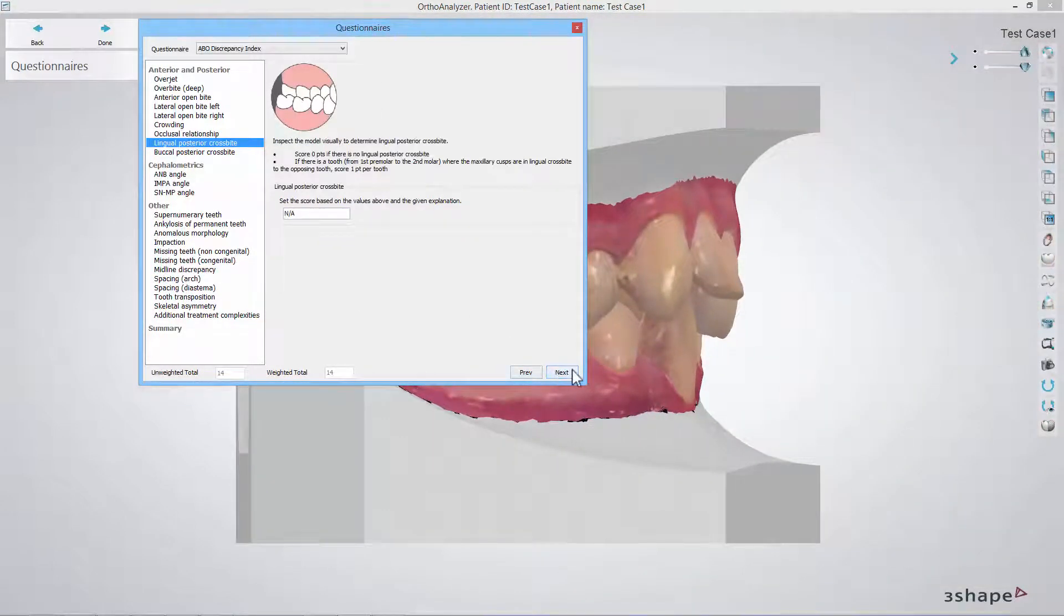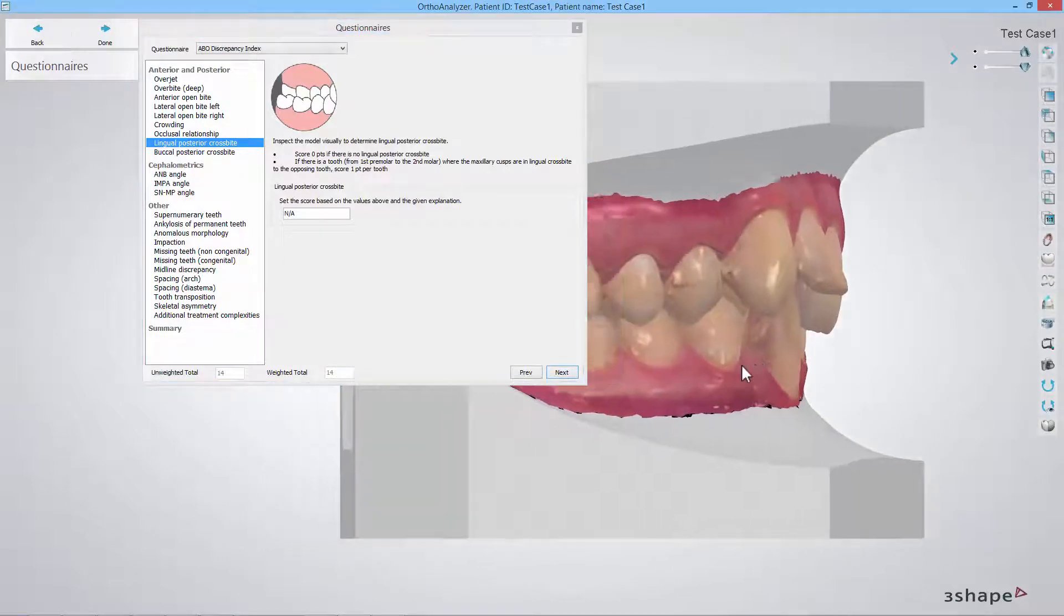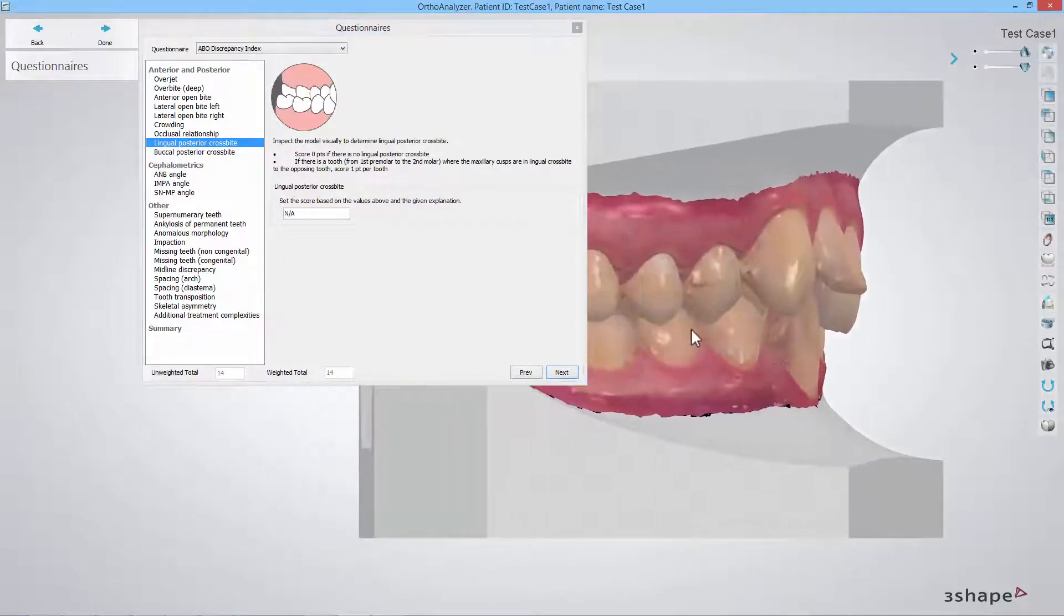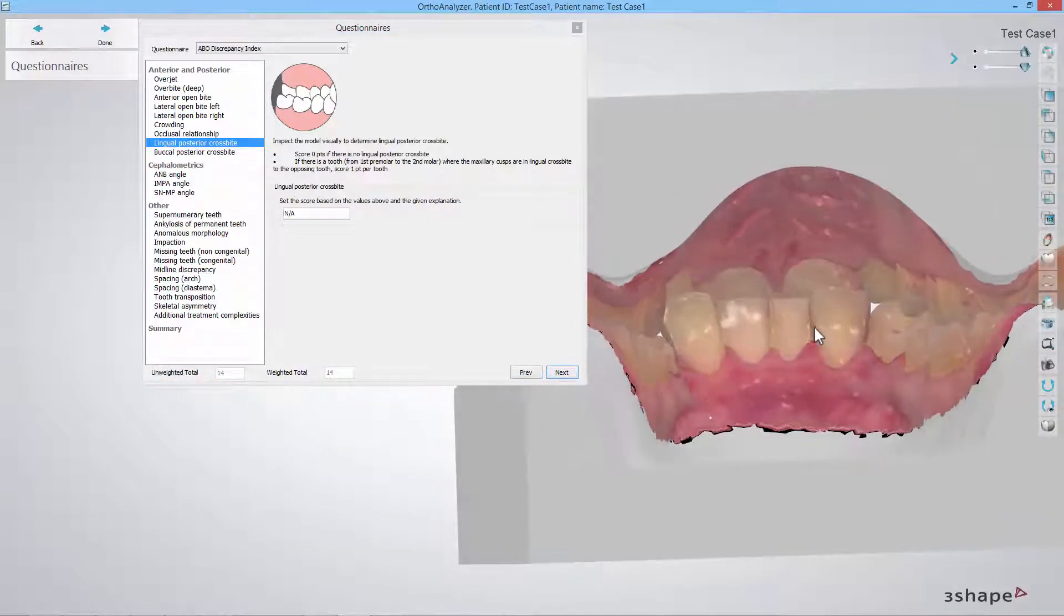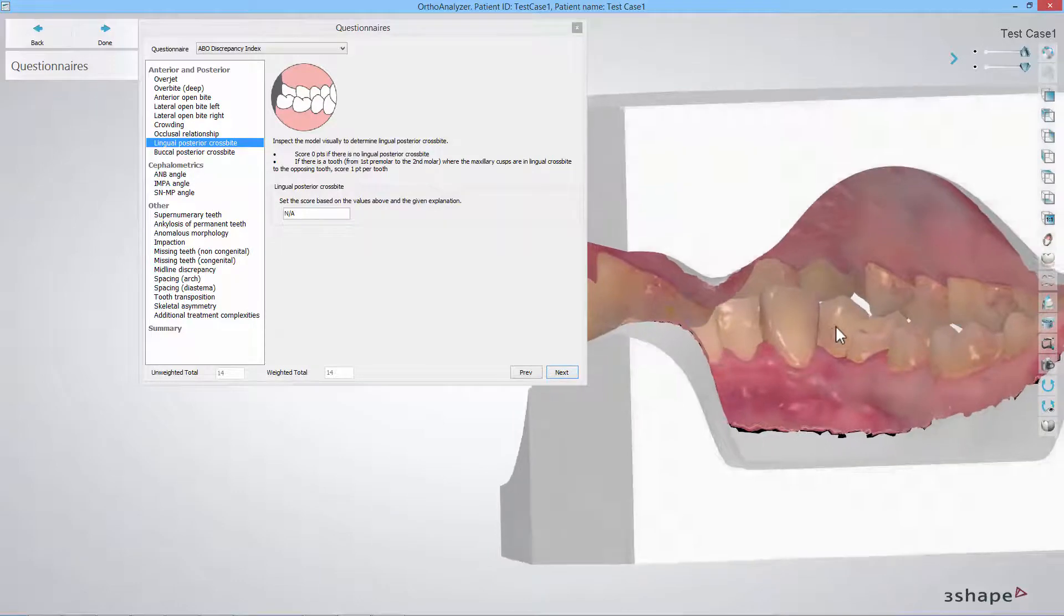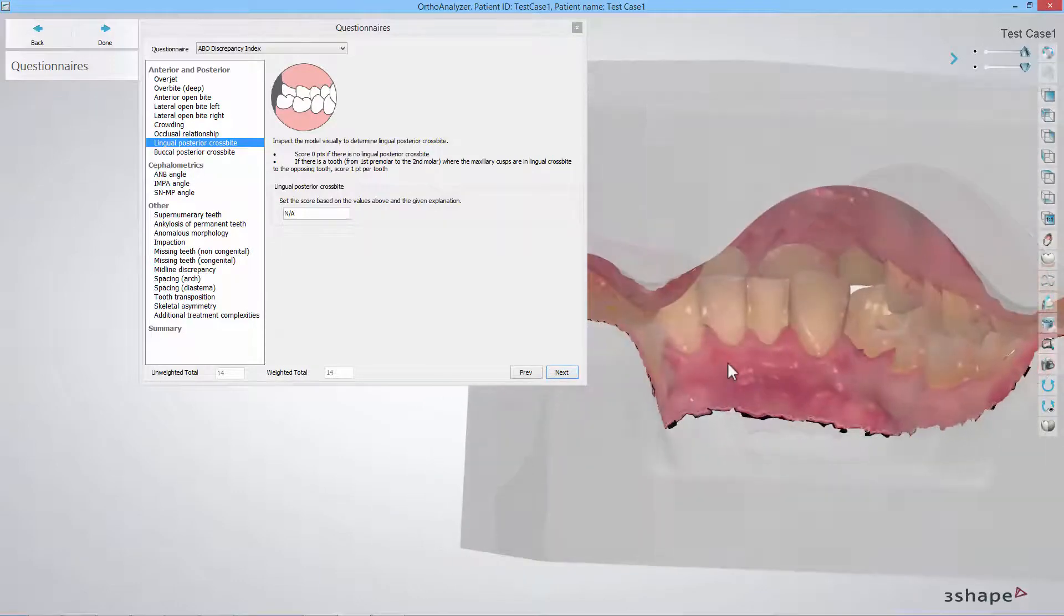In the lingual posterior crossbite step and the buccal posterior crossbite step you should inspect the model from the first premolar to the second molar regarding the crossbite.